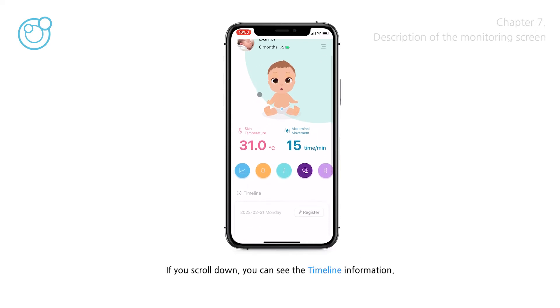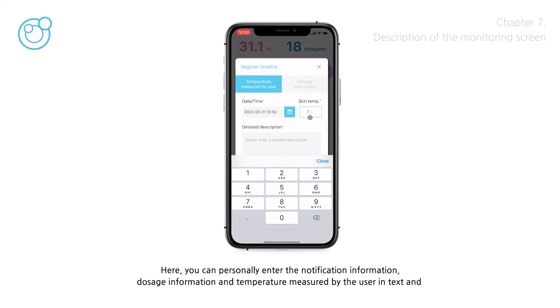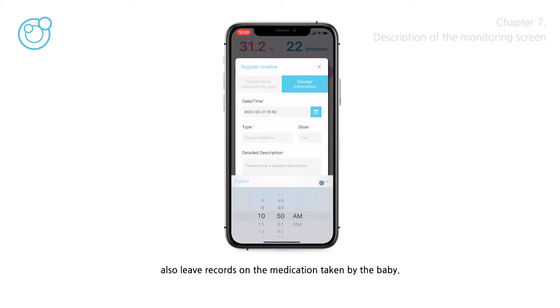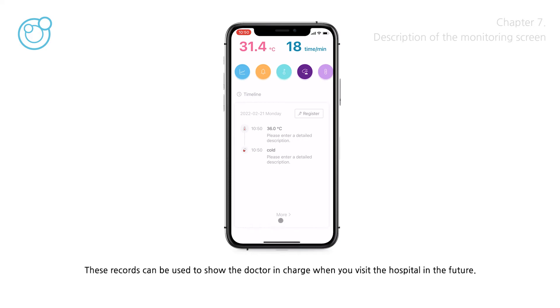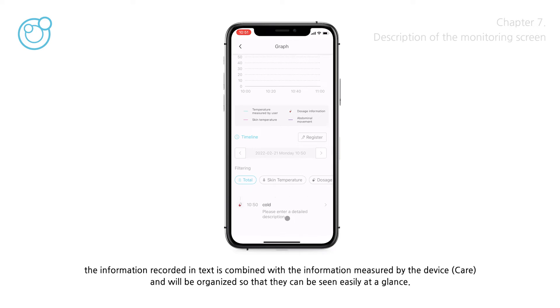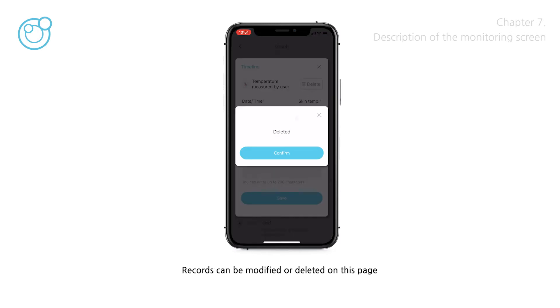If you scroll down, you can see the timeline information. Here, you can personally enter notification information, dosage information, and temperature measured by the user in text, by tapping the Register button within the timeline. You can record the current body temperature and state of the baby in detail, as well as records of medication taken by the baby. These records can be used to show the doctor when you visit the hospital. Tap the more button at the bottom to move to the graph page, where text records are combined with device measurements and organized for easy viewing. Records can be modified or deleted on this page.